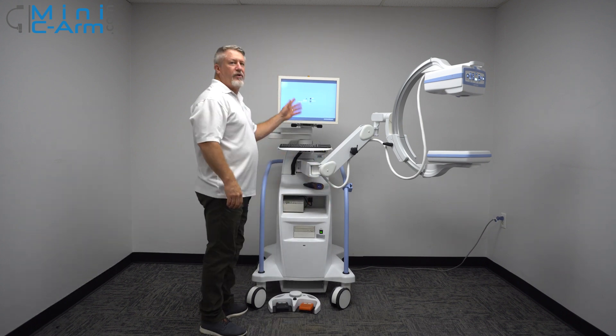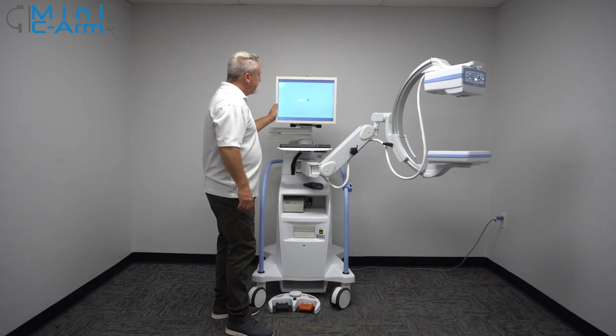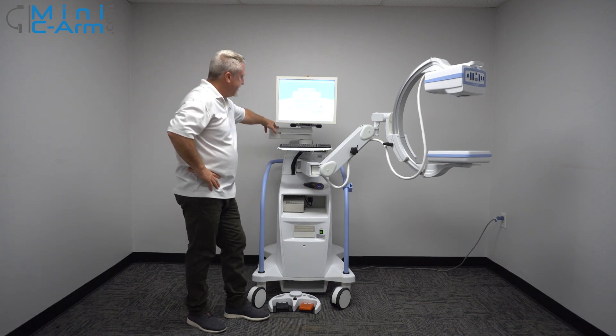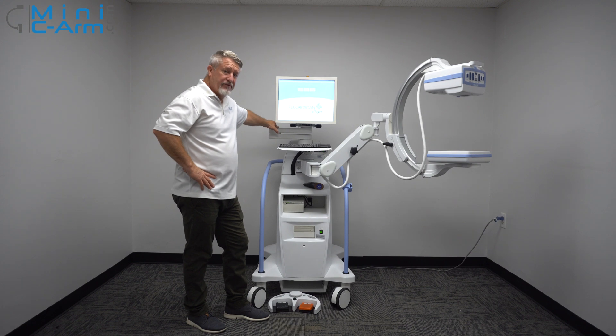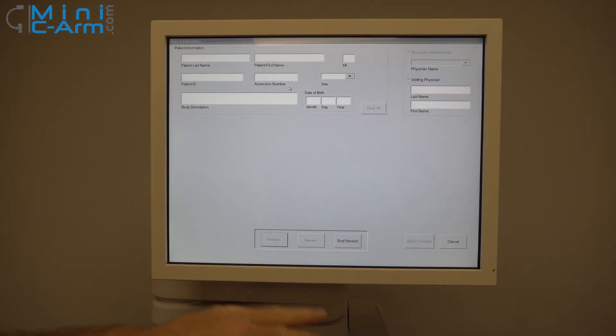Once we get to this screen, always hit the admin button. It takes a couple of seconds to boot into the application. If it doesn't, give us a call. Enter last name, first name, and patient ID — so we'll just throw in here 'Raw' and 'Bacon.' It's got a touch screen which can help you navigate through the boxes.